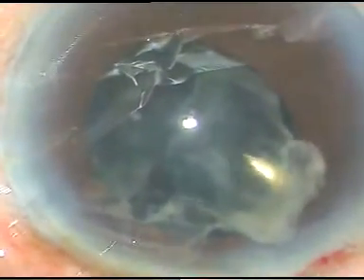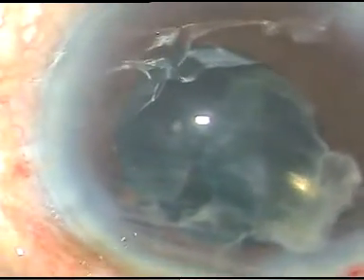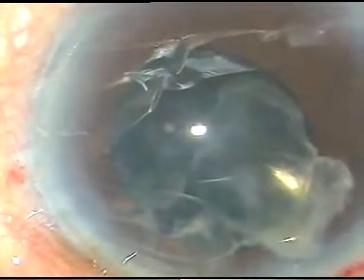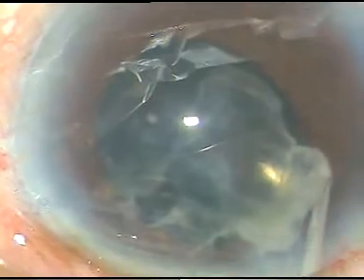anterior chamber. The capsular rent has occurred just in front of the main incision, and some portion of posterior capsule is still there on the other side, on the left side. And now I inject some viscoelastic substance.